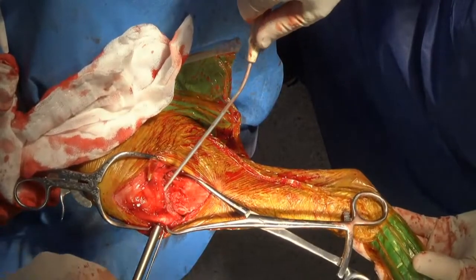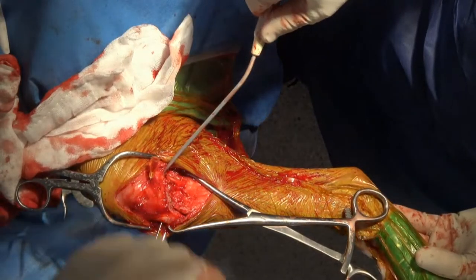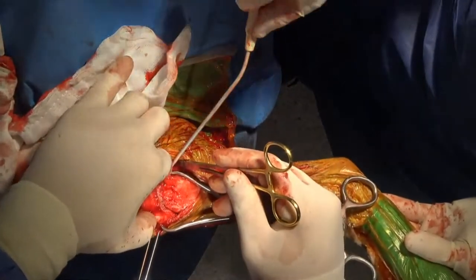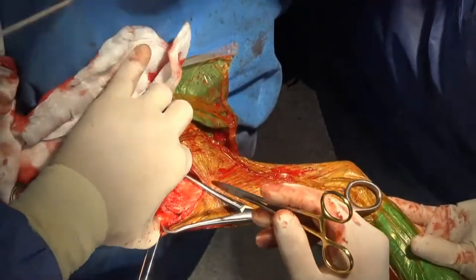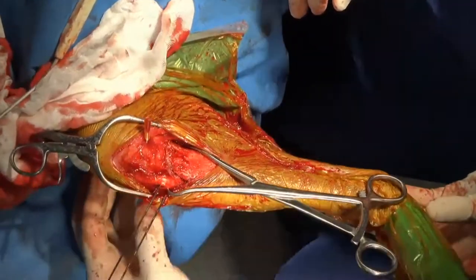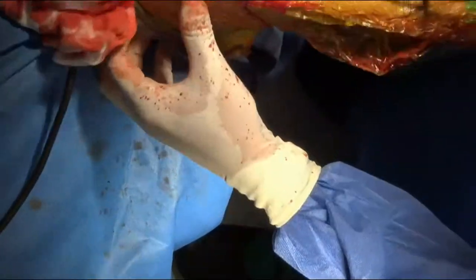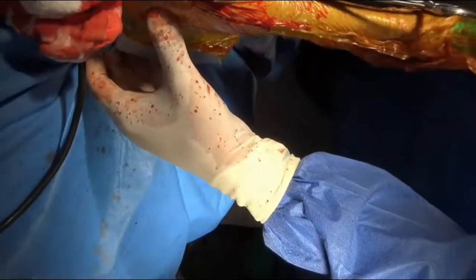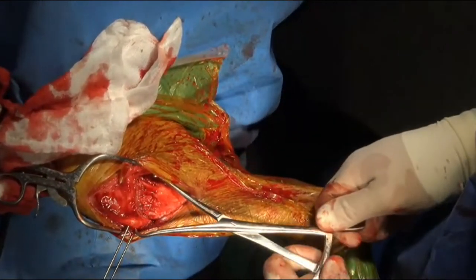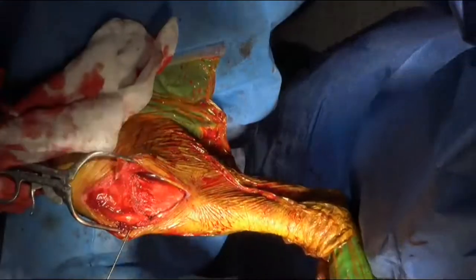And so now it's released. You can take that off. That screw head is sitting in the bone there. You can feel a bit of the screw sticking out there, which is what we'd expect. But I think that's all fine. And that should be pretty solid there now. You can check we've got a pretty good rotation there still. Make sure I haven't done anything weird to the leg geometry. So I think that's pretty good. You can take this off here. So that's going to keep everything in place pretty well now. We can actually pull that other pin out there, Yui.